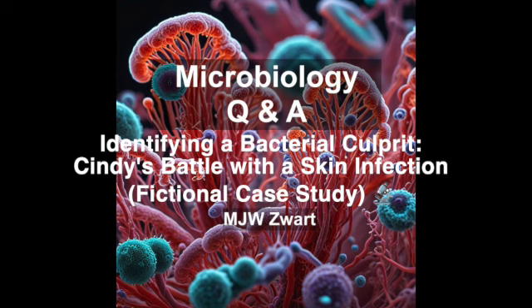So what happens next? How do we make sure Cindy gets the right treatment? Well, identifying the culprit is a crucial first step, but the next challenge is figuring out which antibiotic will be effective against this specific strain. I see. Makes sense. Not all weapons are created equal. Right, so the lab will test Cindy's bacterial sample against a variety of antibiotics to see which one is most effective at stopping its growth. So it's like a microscopic battle to find the antibiotic champion.